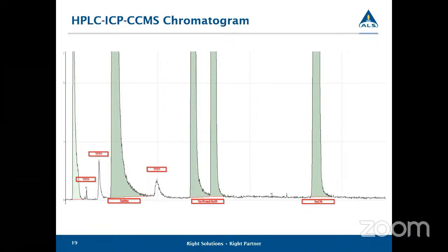So, total selenium doesn't always tell you the whole picture. And sometimes the species, 3 or 4 species, don't tell you the whole picture. So in these cases, we need a lot of communication with the client to see what we can give you and what you're looking for. I believe the most species I've counted in a sample was over 30 clear different selenium species present in a sample. I believe that was in a bioreactor. Not unsurprising that would have a lot of species.